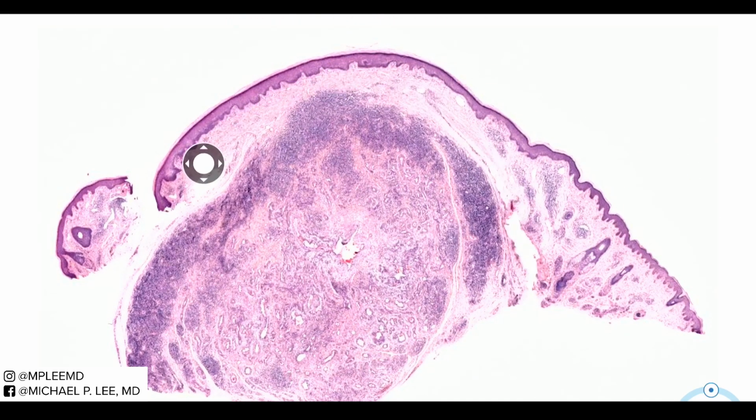And we have this big nodule, right? Big nodule surrounded by these blue cells. The blue cells, when you see that, we're usually dealing with either lymphocytes or plasma cells, right? And towards the center of the lesion, you can see that there's a vascular proliferation. So what I usually like to tell the residents and fellows is that when you see a vascular proliferation that's inflamed, you want to think about pyogenic granuloma first, but also the other thing to think about is angiolymphoid hyperplasia with eosinophilia.